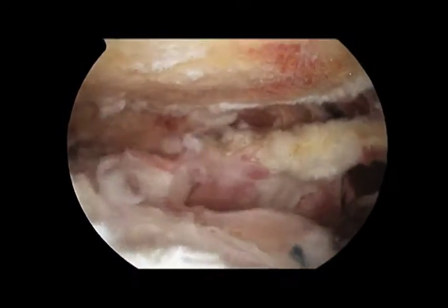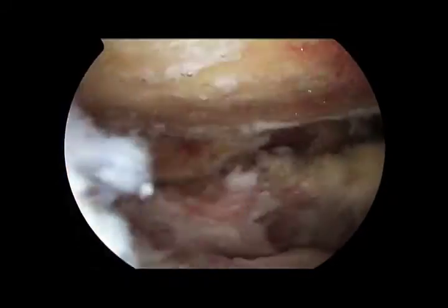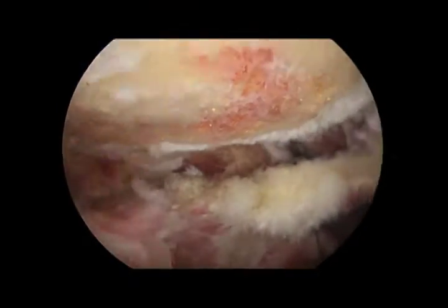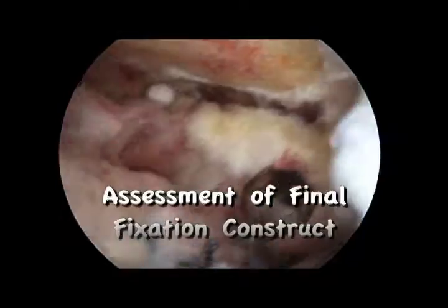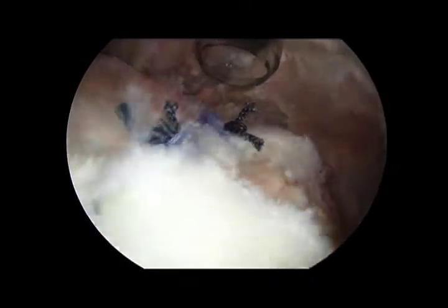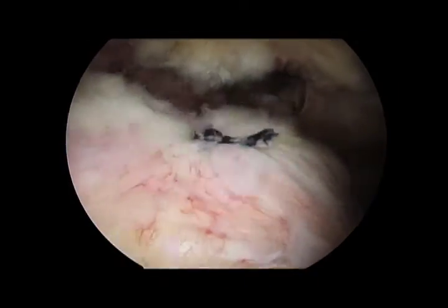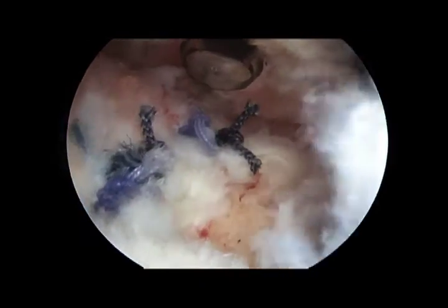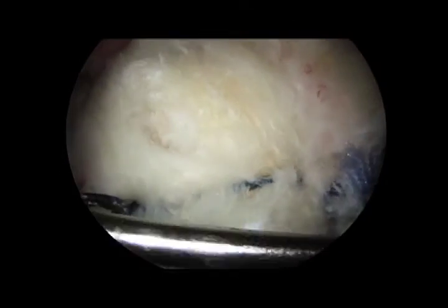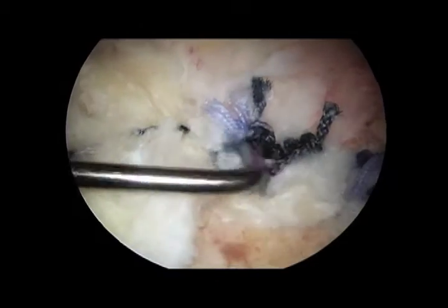Here we see a final view of our subacromial decompression, now with plenty of space between the undersurface of the acromion and the rotator cuff. We also see our fixation construct reducing the rotator cuff back to the tuberosity with excellent fixation. As the arm is internally and externally rotated, we note that the rotator cuff and humeral head move well as a unit.